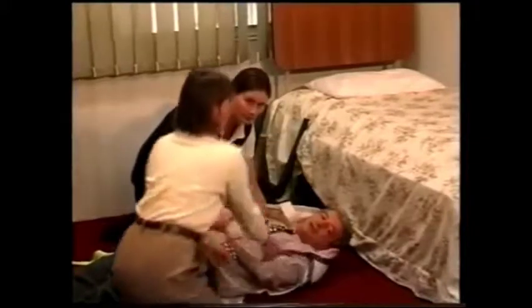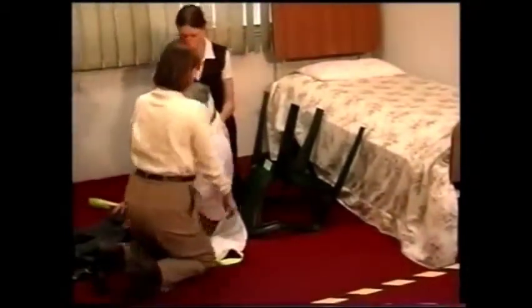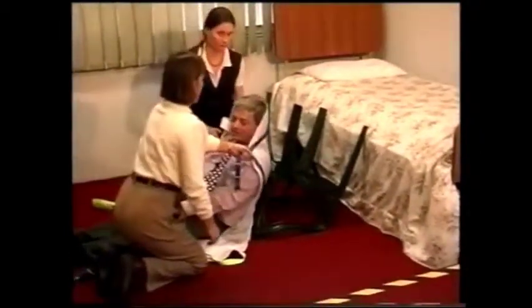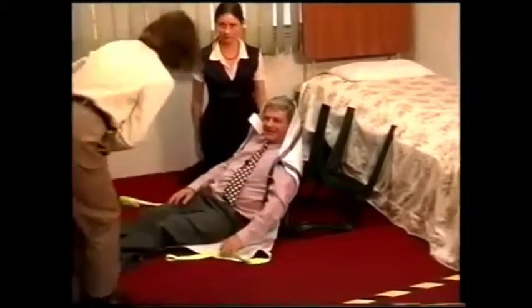Inika, I think you're blocking the camera, unfortunately. Hold it again, and we just keep an eye on the camera. Now, you can put your hand in the loop there, so you don't have to use your little finger muscles. Just one hand in the loop, right? One, two, and lean back. Three. Rightio. Okay, you got me upright. Now, Vicky's going to get that chair, turn it upside down, and lean me back against the chair. Rightio, Inika, you can go now. Thank you very much.